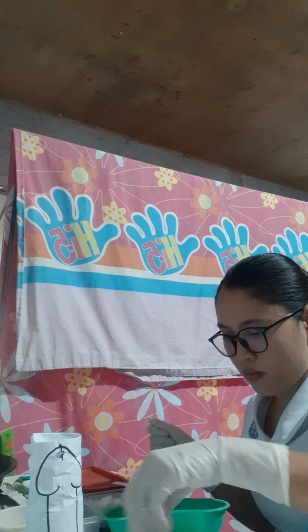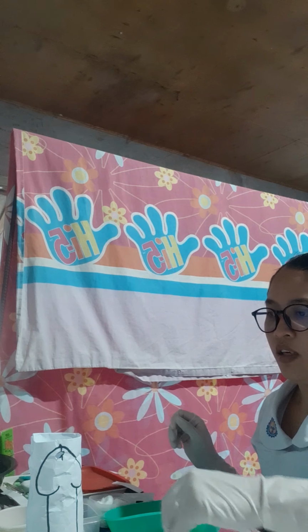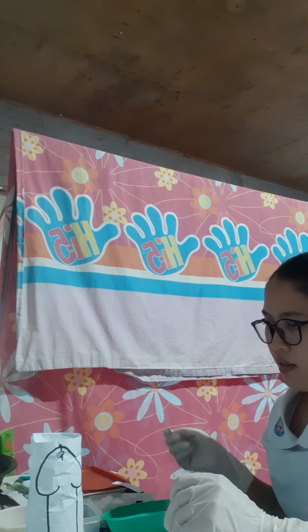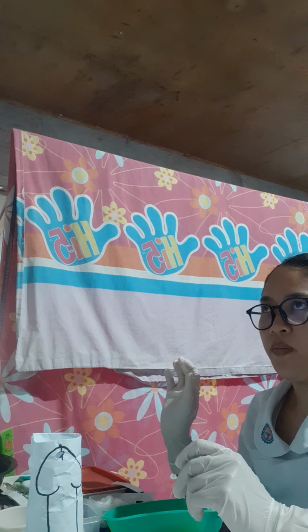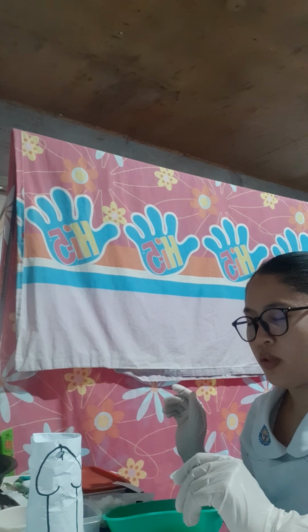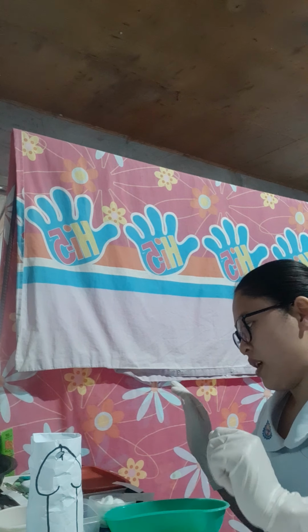Next, determine that the catheter tip is properly lubricated, and the male length should be 12.5 to 17.5 centimeters, which is 5 to 7 inches. Then cleanse the urethral meatus.